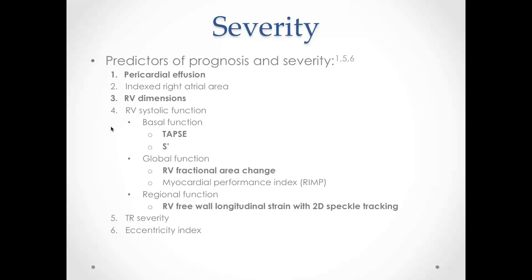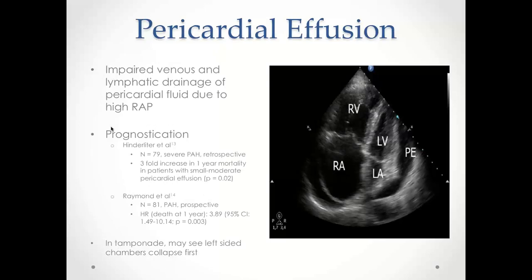Here is an example of a patient with severe pulmonary hypertension. We can immediately identify: severely enlarged right ventricle, D-shaped septum, significant RV enlargement with the RV dominating the apex, severe right atrial enlargement, underfilling of the left side of the heart, and a pericardial effusion.